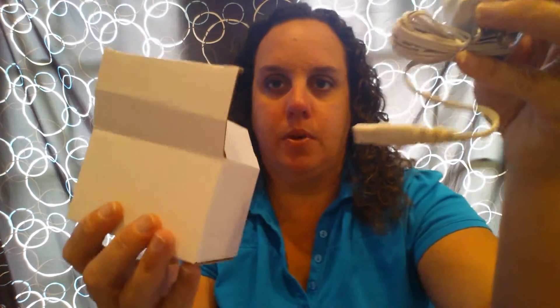Once you open up the box, you have your instruction manual with some instructions, a troubleshooting guide, and some additional information. You also have your charger, which comes in a separate little box.